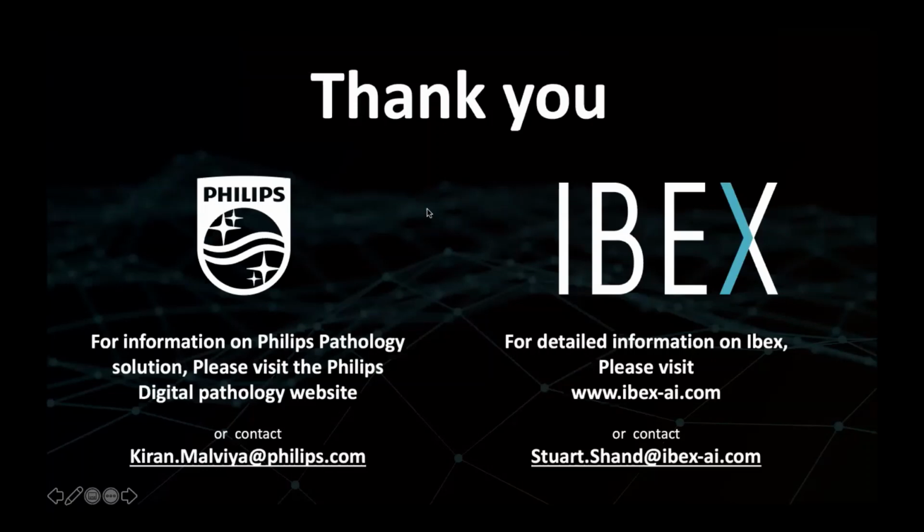Thanks for the question. AI today, the second read, doesn't add much to the time spent on it. We really focus on the heat maps, go to them, and decide whether it's wrong or right and go on. We have not started yet with the first read. We're about to start, so I cannot give you the results so beautifully as Delphine has given. I hope we will have the same experience. For now, the second read does not prolong the time at all.